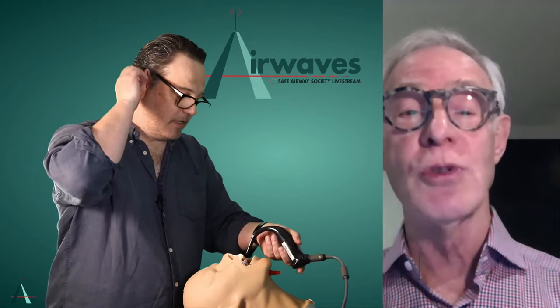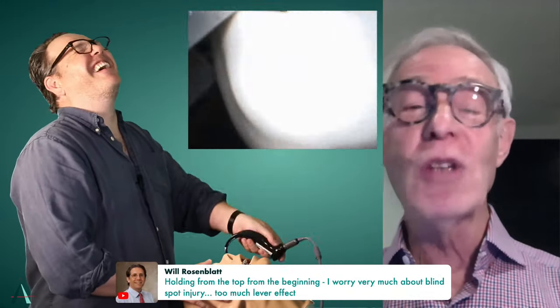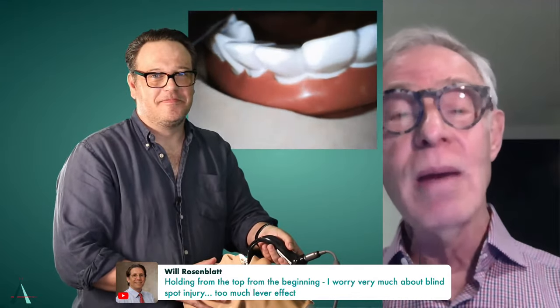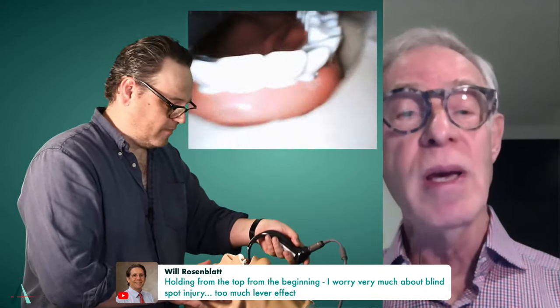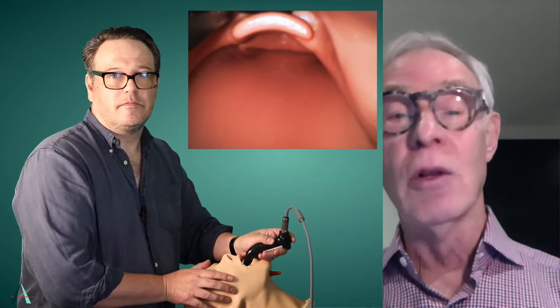Can I just emphasize the importance of looking in the mouth as you insert the endotracheal tube to avoid soft tissue injury? It's not the device. It's not the stylet. It's the technique that causes those soft tissue injuries. Now, you were saying you don't need to look in the mouth when you're inserting the blade, presumably because you have that vision on the screen. Is that right? Well, I watch the tip of the blade going. I'd hate to be putting it in the patient's nose. I watch the laryngoscope as it goes in the mouth, but then I turn my attention to the screen. I advance the laryngoscope to an appropriate position. Then I take my styleted endotracheal tube, and I look in the mouth as I'm inserting it and advancing it until it appears on the screen.